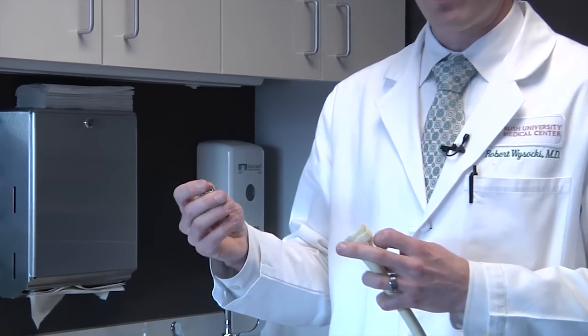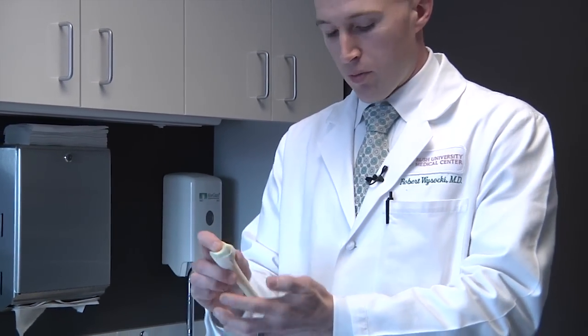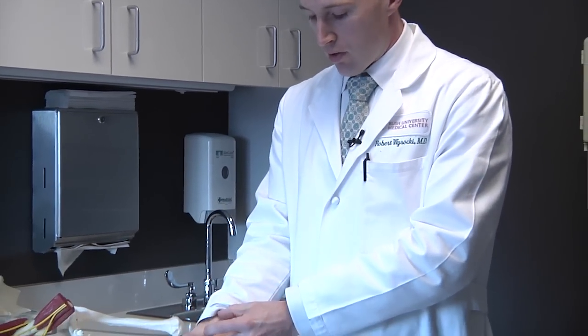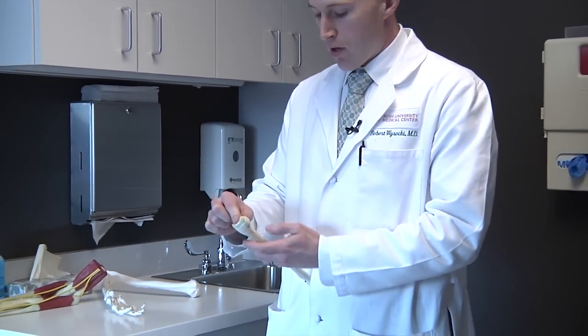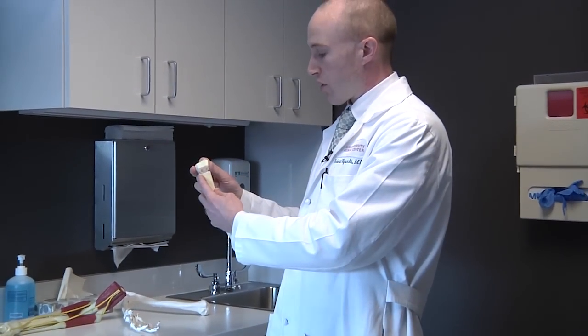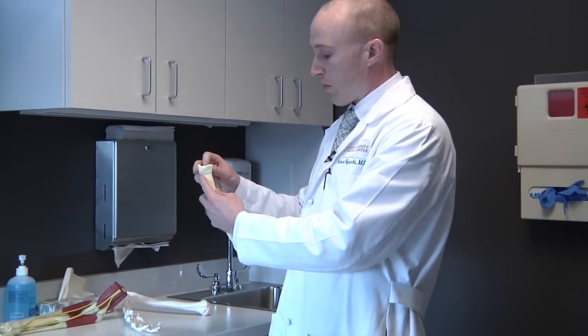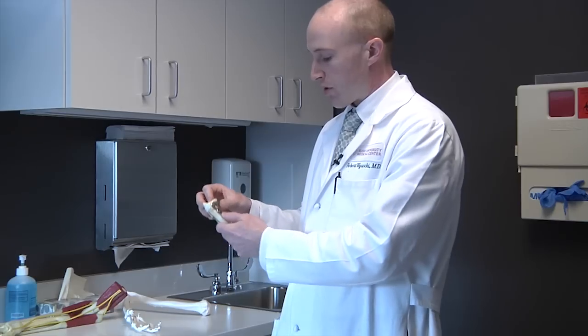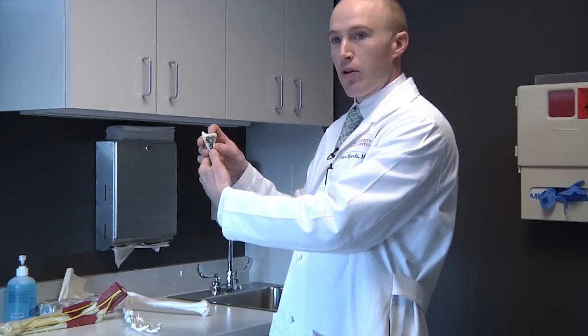There are several manufacturers that make them, but just through a small incision on the undersurface of the wrist, so it's usually about 2 inches long, just goes from about there to there, we're able to set the fracture back in position. Instead of being brought back, we can then fold it over the top the way it's meant to be, and then we put on this strong plate and screws on the undersurface of the bone. He said, you know, I would recommend as an active person that you have surgery.